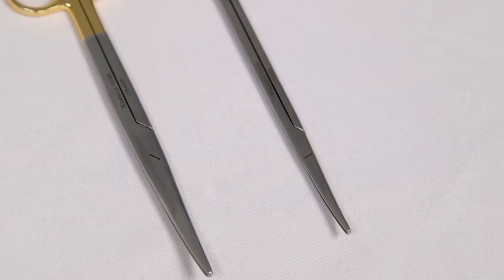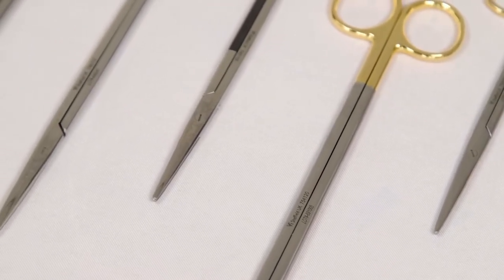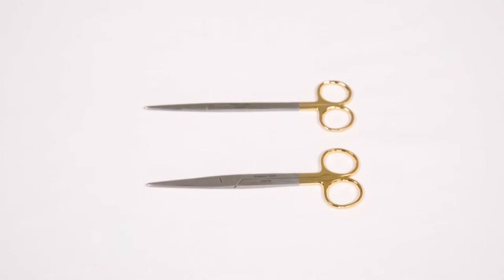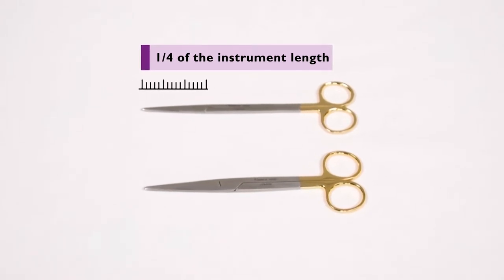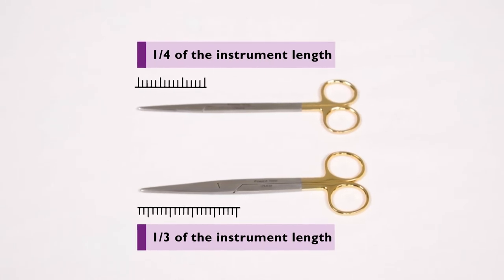Compared to Mayos, Metzenbaums have a slimmer profile. The blade size relative to the instrument length also differs between the two styles. Metzenbaum scissor blades occupy approximately one-quarter of the overall instrument length, whereas Mayos scissor blades occupy approximately one-third.